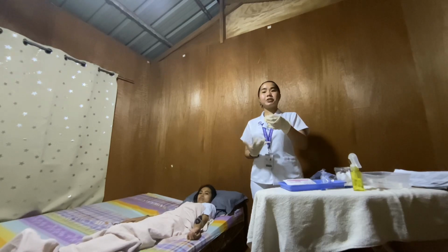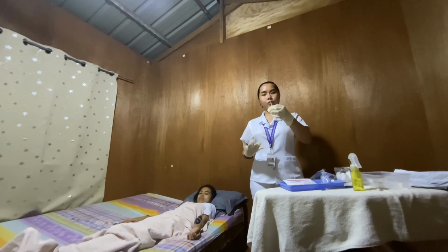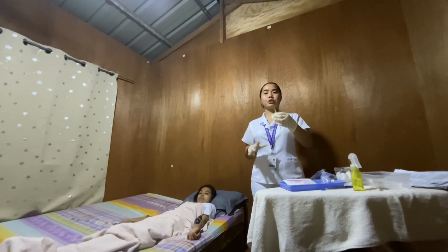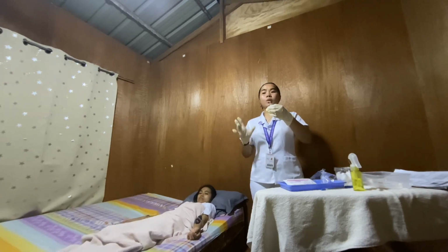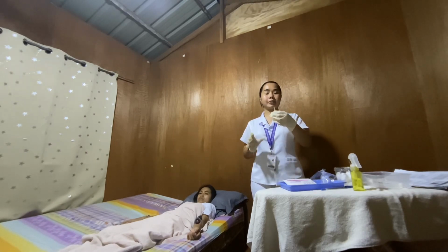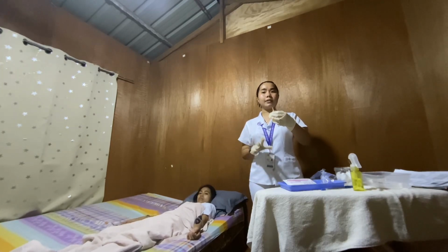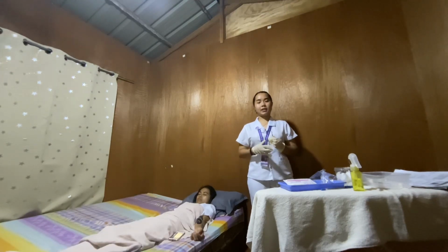Grasp the syringe in your dominant hand close to the hub, holding it between your thumb and forefinger, and hold the needle almost parallel to the skin surface with the bevel of the needle up. This is because the possibility of the medication entering the subcutaneous tissues increases with using an angle greater than 15 degrees. Now I will be injecting the fluid.